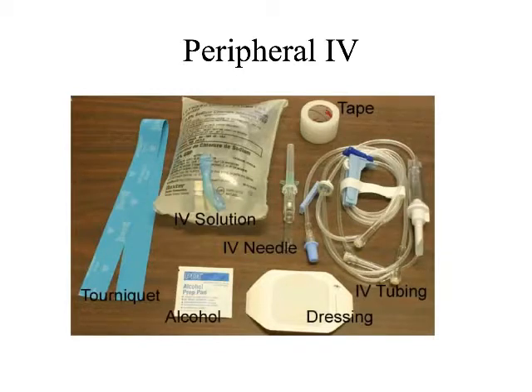I've got my Heplock or whatever thing that I'm going to use to stop the bleeding. I've got that opened already. I've got my IV access needle and everything opened up and ready to go, right? So that I'm not scrambling to grab things while the patient's bleeding all over the place and then I look like a dork, right? Plus there's blood everywhere.